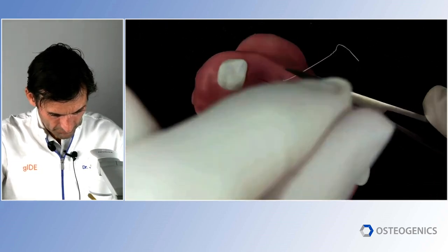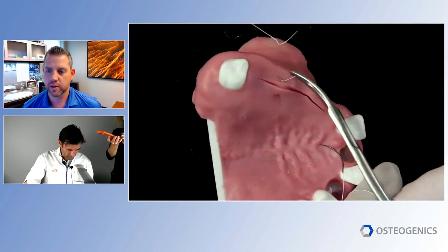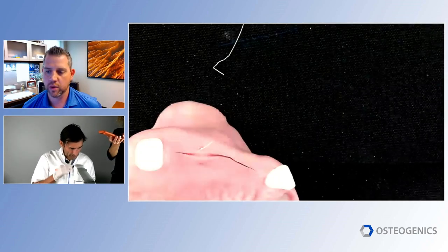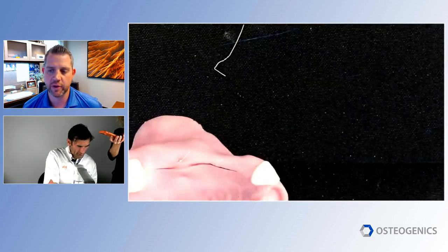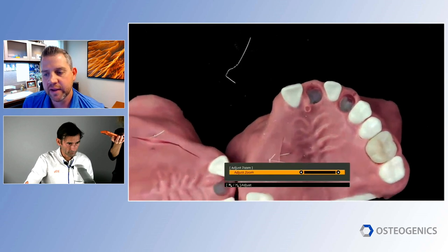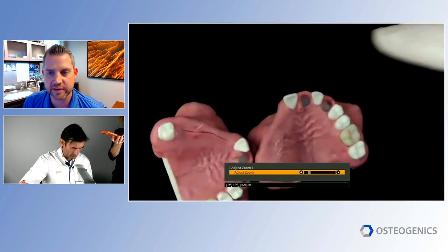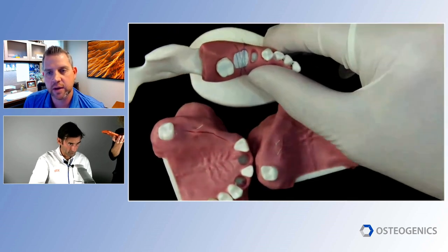So, am I live, Steve? Okay. So I demonstrated the horizontal mattress. Somebody is saying that on the horizontal mattress, sometimes they see that the suture pulls through on the lingual aspect at times. Do you have any tips or tricks to avoid that?